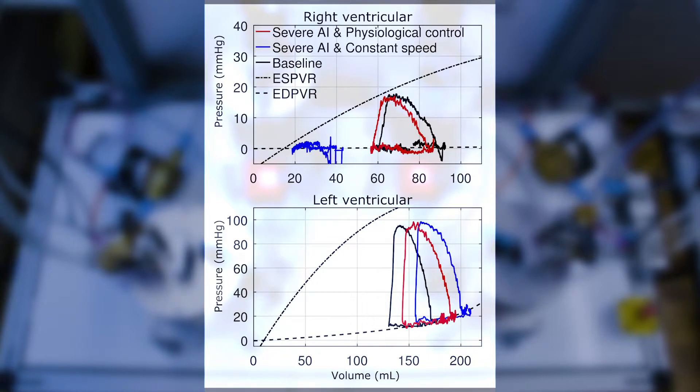Under severe aortic insufficiency, the right and left ventricular pressure volume relations are shown. Physiological control approaches, shown in red, allowed to efficiently balance the fluid between the systemic and the pulmonary circulation. During constant speed operation, depicted in blue, suction occurred in the right ventricle and the left ventricular volume increased.